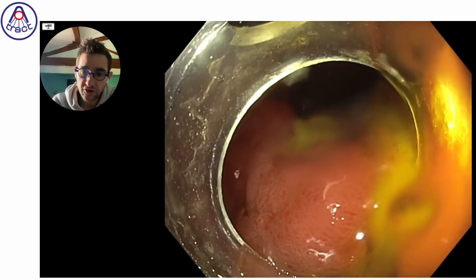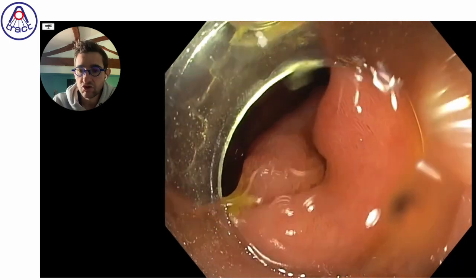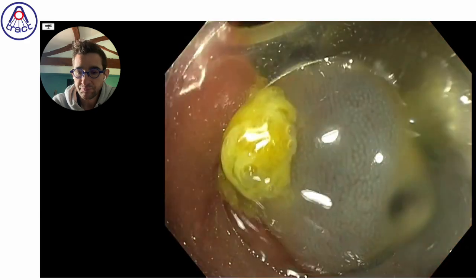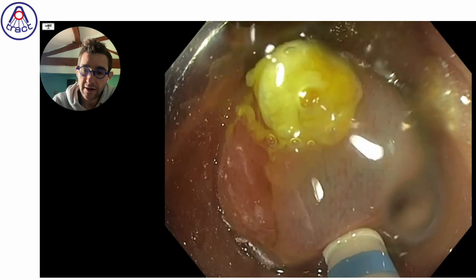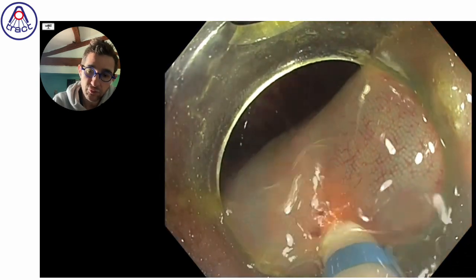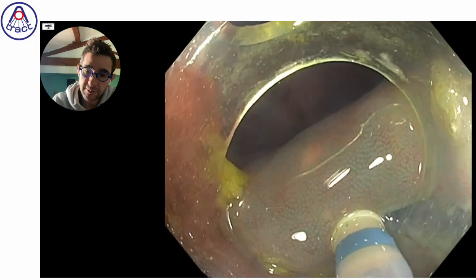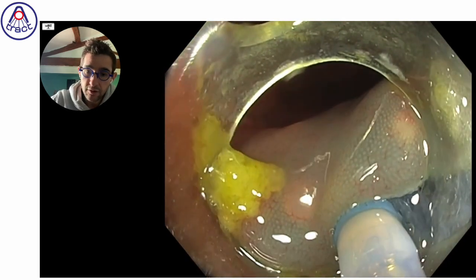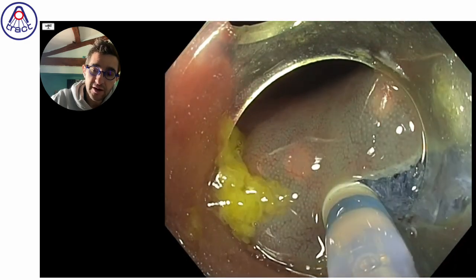So we did first an injection with glycerol mix using a conventional needle. It's better usually to have a needle because you reduce the risk of hematoma while using this. So I re-inject usually with the knife and begin to move from a dot at the good depth. And after, I do my incision, trying to keep the lesion close to the cap in order to control the distance, the margin between my cap and the area I want to cut.